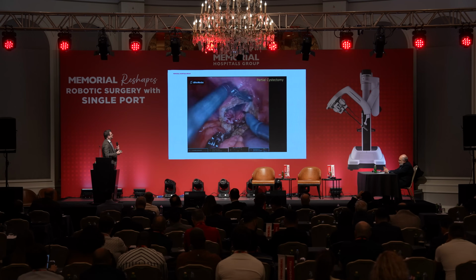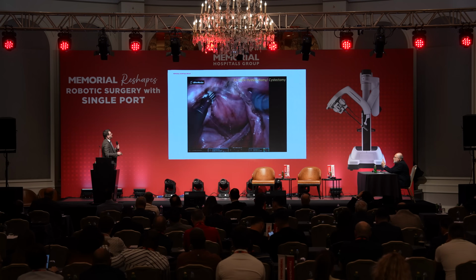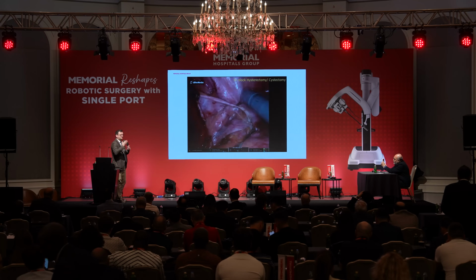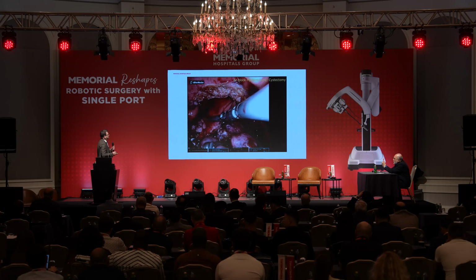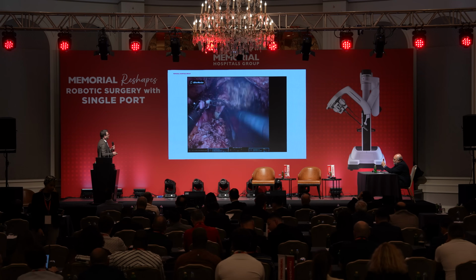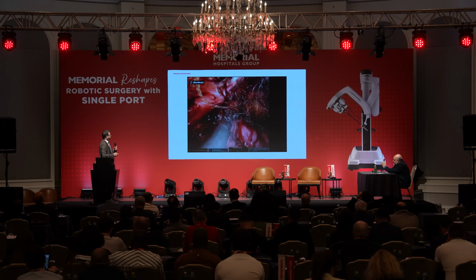Now we are getting into the urinary bladder. This is a totally robotic procedure. So of course you have to start with easy cases, but the idea behind doing all these MIS procedures is to do all types of oncological procedures from the access site, which is multiport or single port, and not to harm an organ which is not related to the disease itself, such as the abdominal wall.